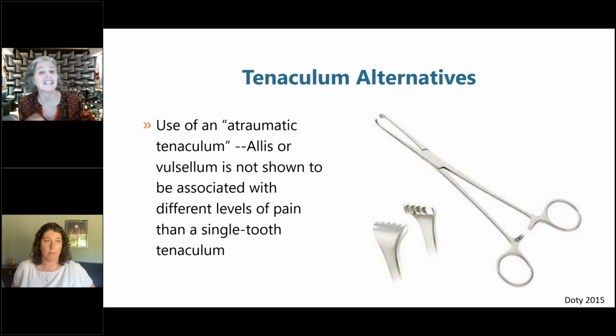And let's say the person was anticoagulated. That would be one of the only situations where you'd think about wanting to really stem that blood. But otherwise, the blood's going to be minimal and eventually within a few minutes, not any at all. So that's a way to be patient-centered, is to get out of Dodge when you're done and not try to just prevent any bleeding.